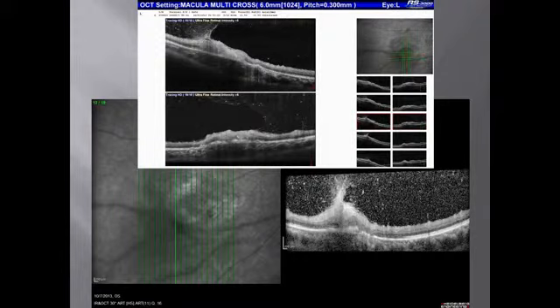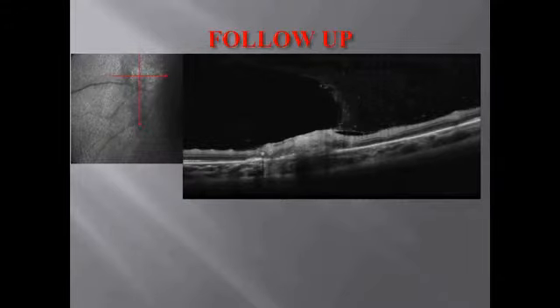So this is toxoplasmosis in an active form, and if you look at the vitreous just adjacent to that whole inflamed lesion, it gives you this very strong density of active cells, which is picked up very well with this scan. And this is on follow-up. You treat the patients and you can actually see how well that whole area, apart from what happens clinically, you also see on the OCT. So it's a great way to document how this whole inflammation is going down in an objective manner.